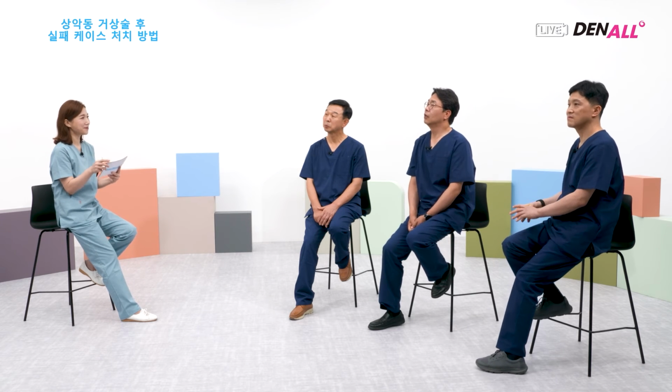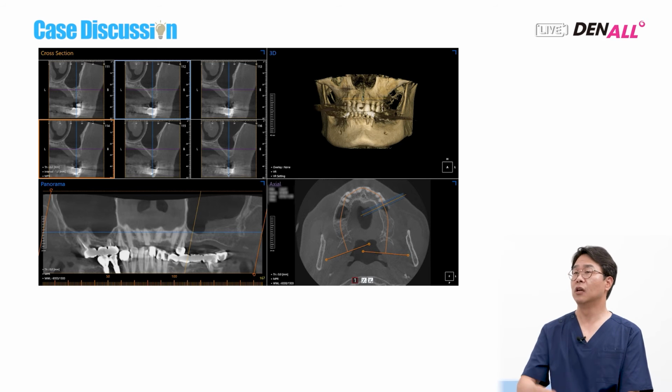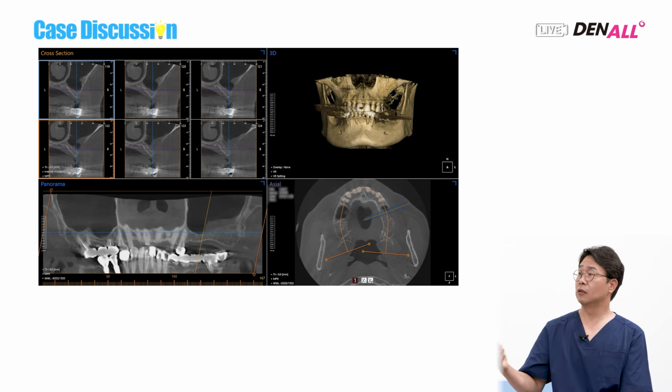This is really regrettable. After surgery, infection can occur, but infection gets large and the graft materials need to be removed. As I can see here, it is not completely healed. I believe in the general hospital, graft materials were removed, but still the infection was not brought under control.